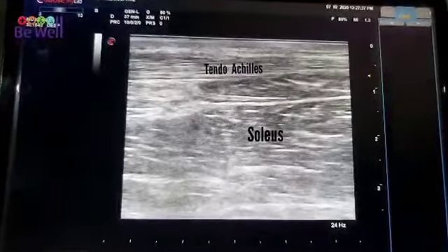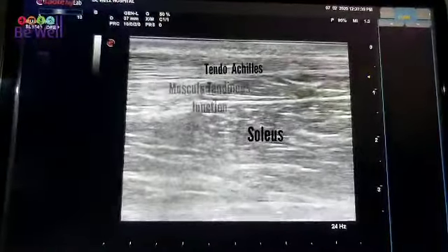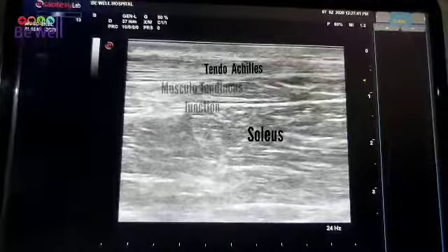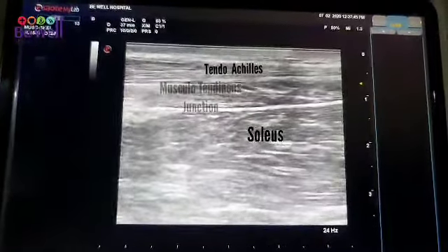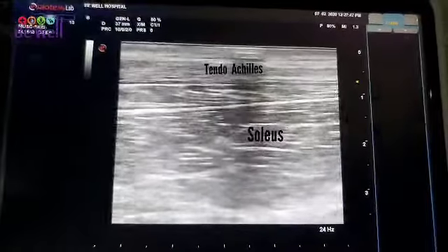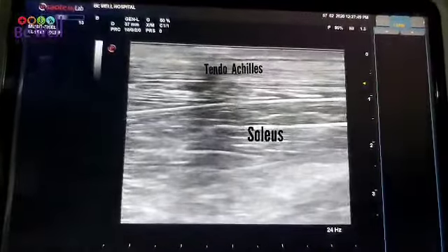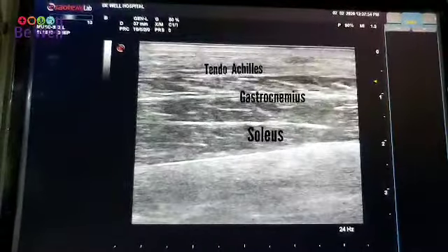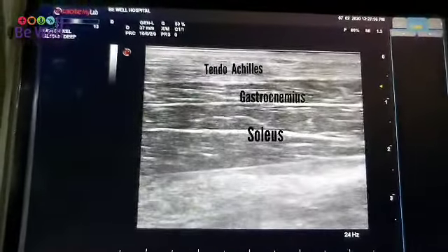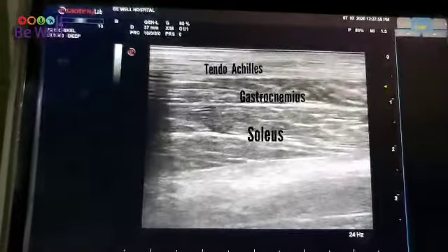I move up. Now you can see the soleus, which is coming down below the tendo Achilles. Now you can see the tendo Achilles changing into fibrillar structures, and now this is the gastrocnemius.